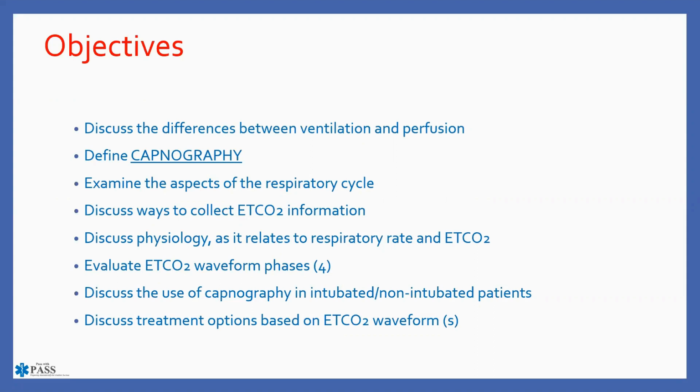And that's why really we get into capnography and it being a Class 1 recommendation from the American Heart Association, because we know that patients that are just simply on pulse oximetry don't typically desaturate very quickly. There's a slide in here and we'll just talk about that very quickly.